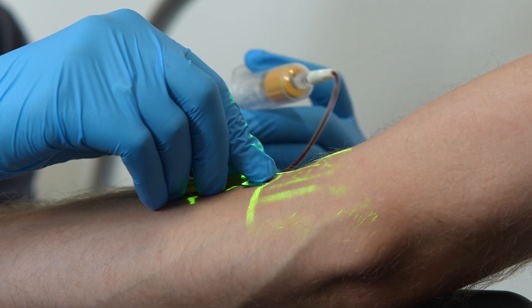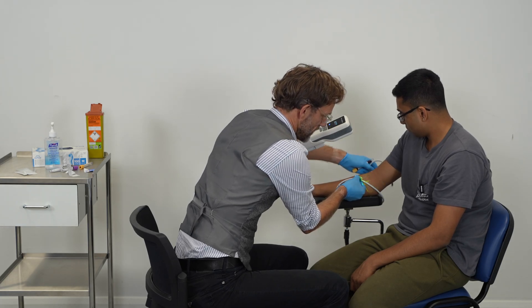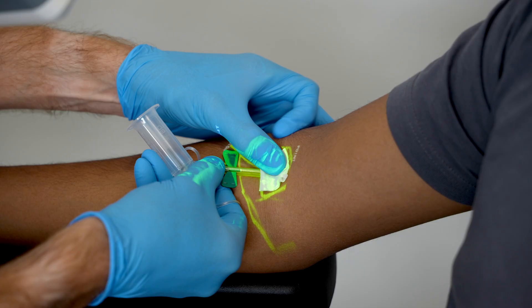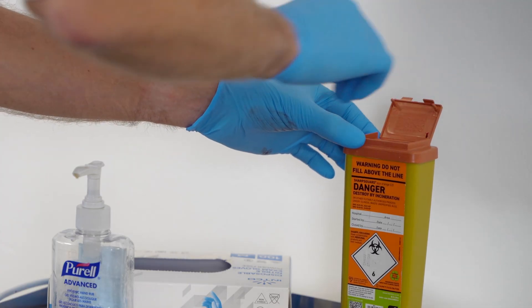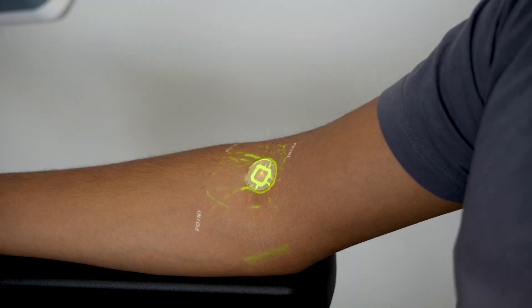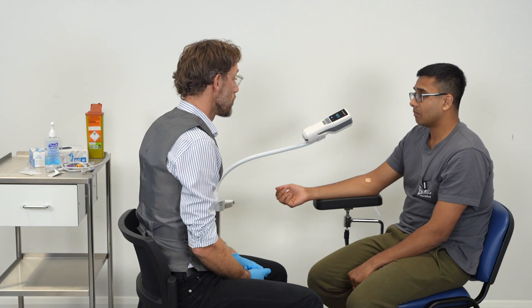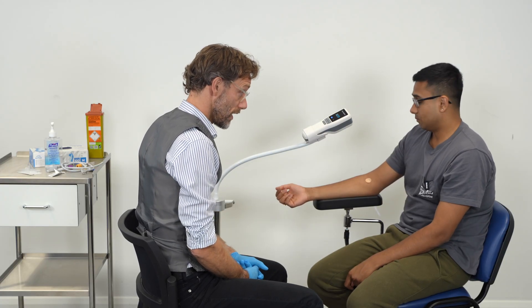And we're just going to pull the tourniquet off. Take the needle out and put that in the sharps bin. And we'll just apply the plaster there. So we've done well with that — there were no problems with taking the blood.